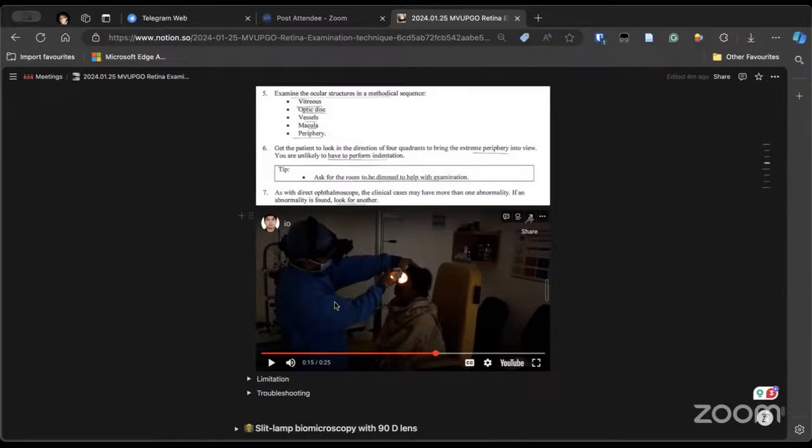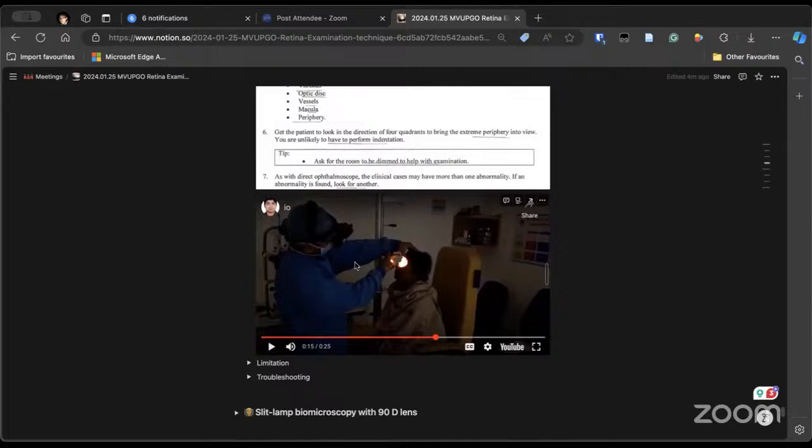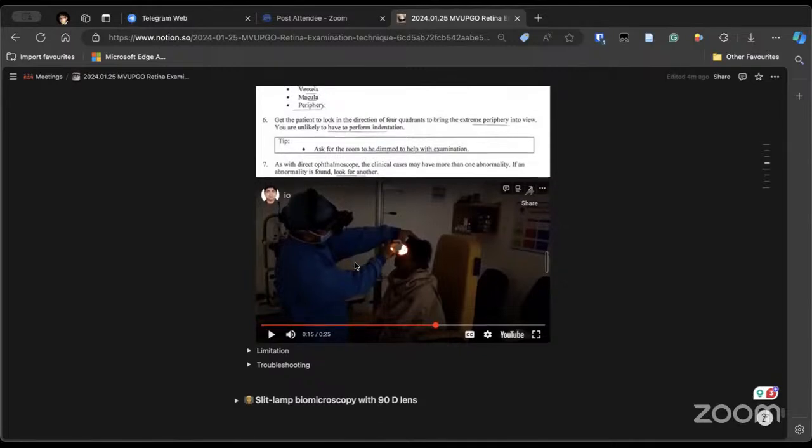Or what specific advantage does it give me? Direct visualization of the field along the light rays. No, the point is when the patient is seeing superiorly, the pupil is becoming oval, horizontally oval. Okay, do you agree or not? So the visible part of the pupil will appear like a horizontal oval to you.